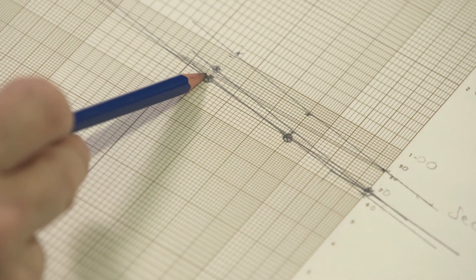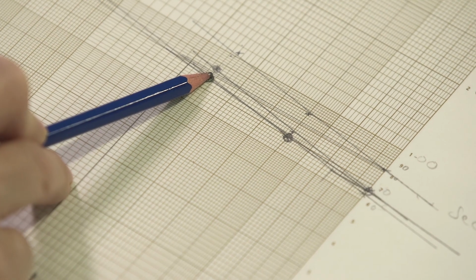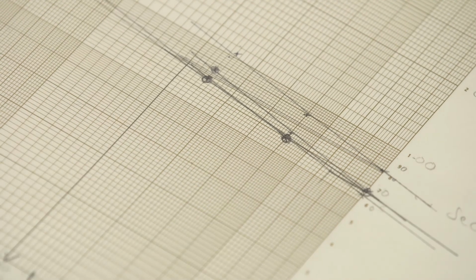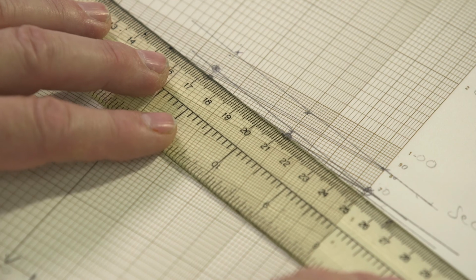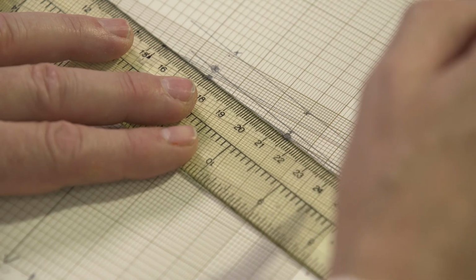But the other 2 sit almost exactly on the calibration line. Just double checking the clotting times. Yeah, practically exactly on the calibration line. And therefore, both giving a straight line parallel to the standard. So from those 2, we could conclude that actually the concentration, drawing the straight line, is 100% of the concentration in the reference material, 100% of 94 international units per deciliter.